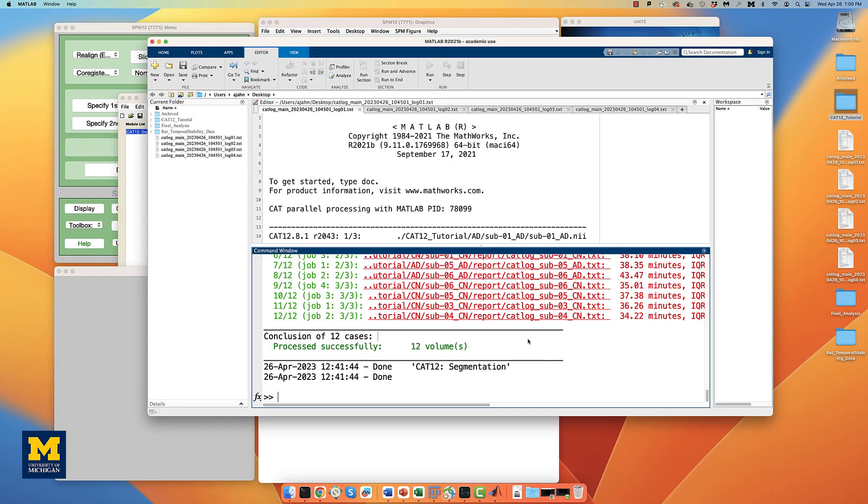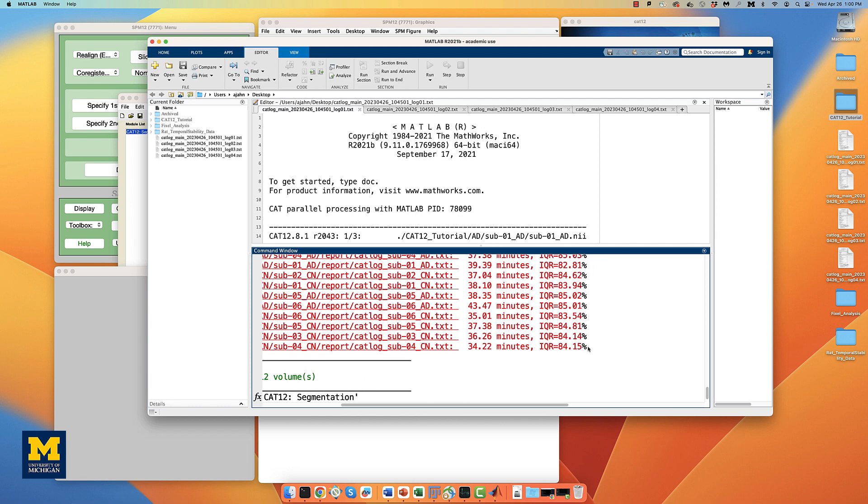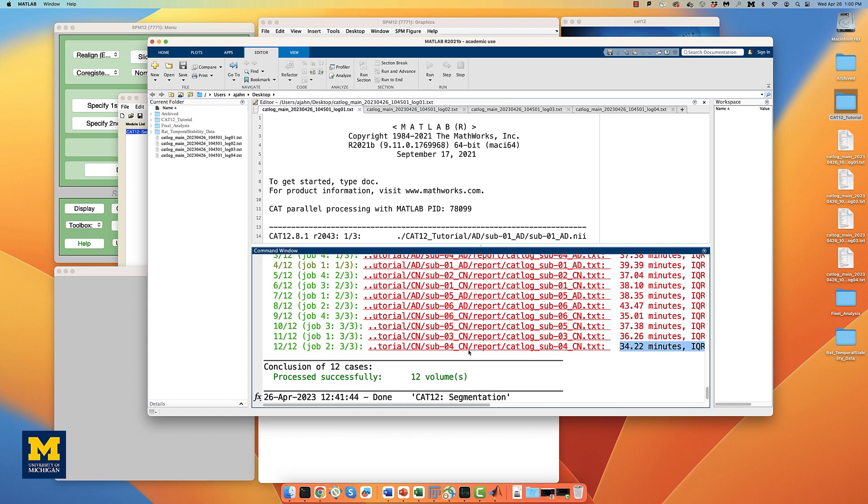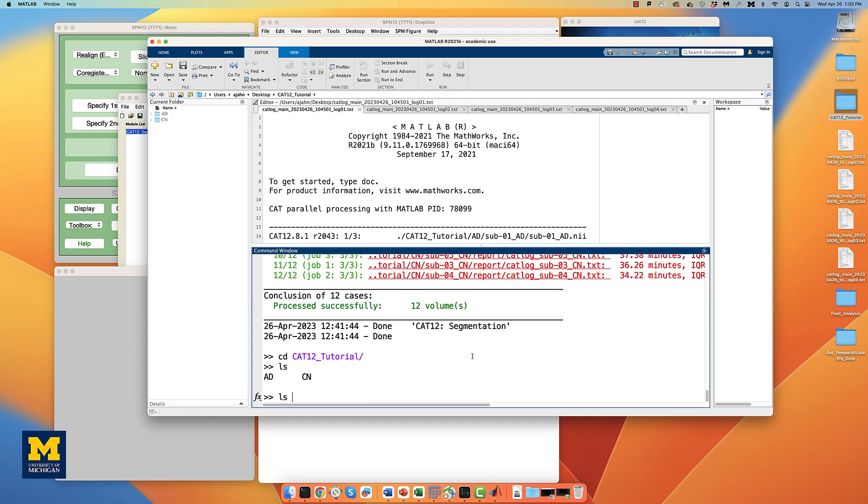When all of the jobs have finished, you will see the completed jobs listed in the MATLAB terminal, along with the time it took to complete the job, and an IQR value representing the quality of the anatomical scan. In my experience, most jobs take around 30 to 45 minutes on a typical iMac computer, and the IQR for most open access databases is around the 75% to 85% range, representing average to above average quality.